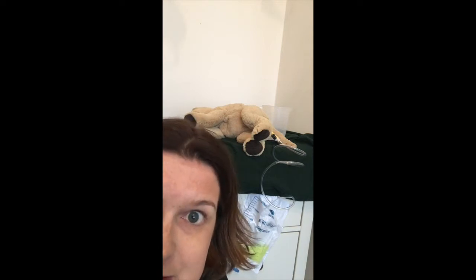Sorry for the odd angle, but I suspect you're looking at the equipment and realising we have a little puppy, we have a lovely urinary bag, and so we are going to do the collection of urine from a closed collection set.